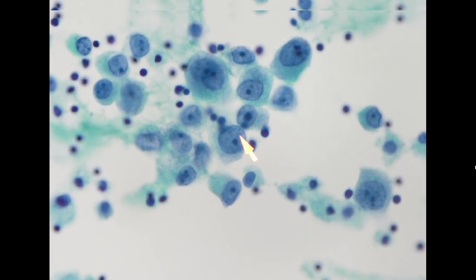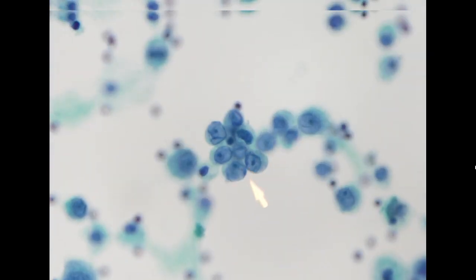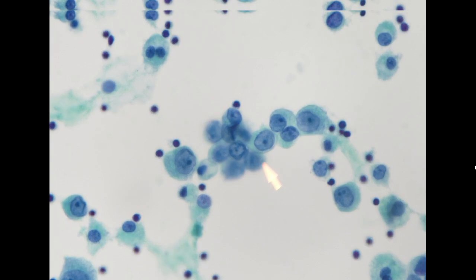You can see these are vesicular, and the nuclear contour can be quite irregular. You see a big notch over here, another notch over here. These are consistent with poorly differentiated adenocarcinoma. The patient also had a history of lung cancer and has been treated.